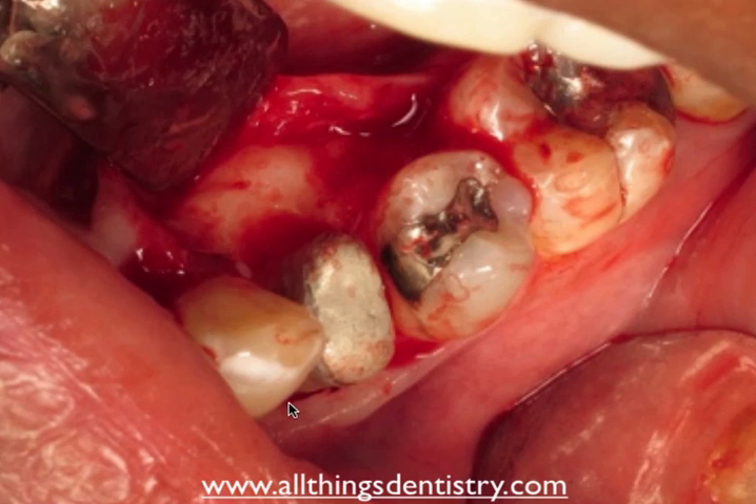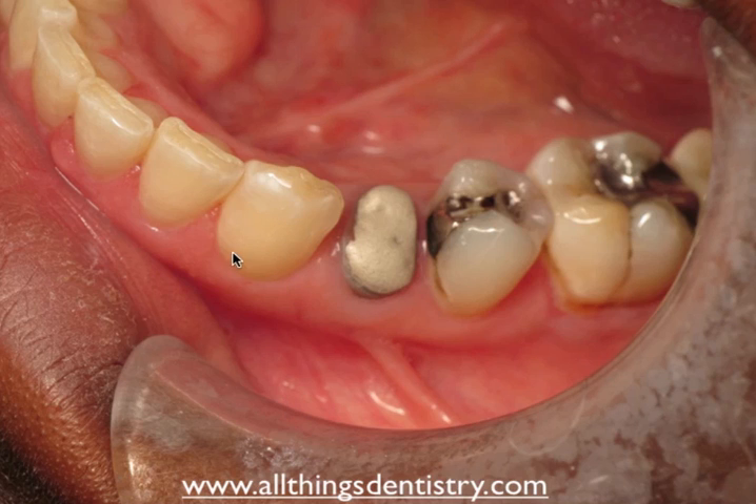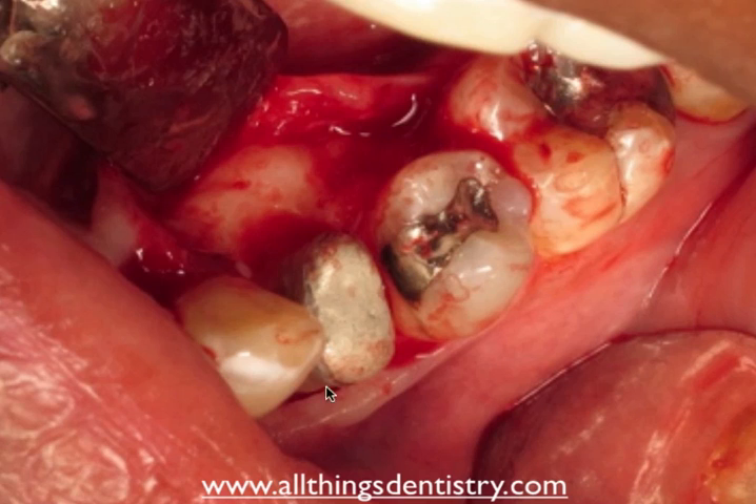We elevated a full mucoperiosteal flap from the mesial buccal line angle of the canine to the distal buccal line angle of the tooth behind it, on both the facial and lingual surfaces. Here you can see it's elevated. We've already completed the ostectomy and osteoplasty portion on the facial — that's fairly straightforward. But on the lingual is where you can see the issue: if you don't remove the lingual tori first and just do your crown lengthening, you get this concave, crater-like shape that doesn't mimic the standard osseous anatomy you'd like.